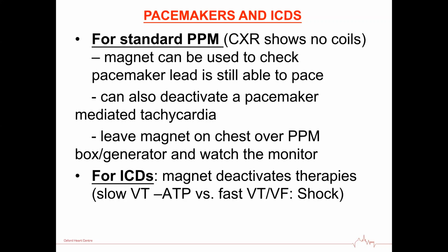Obviously, the only situation you want to be doing that in is if you've decided someone's for DNA CPR because of COVID-19, they've got an ICD and you can't get it deactivated. You do not want that device inappropriately shocking them. That's highly unpleasant. So you would leave the magnet over the box if you've made them DNA CPR until a cardiac physiologist can get there and definitively turn it off.